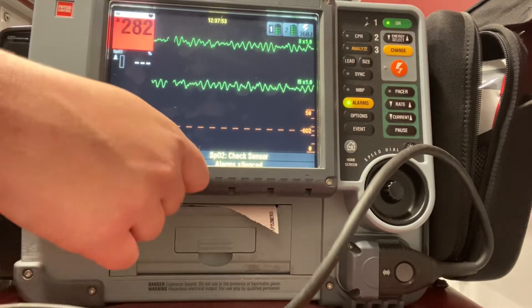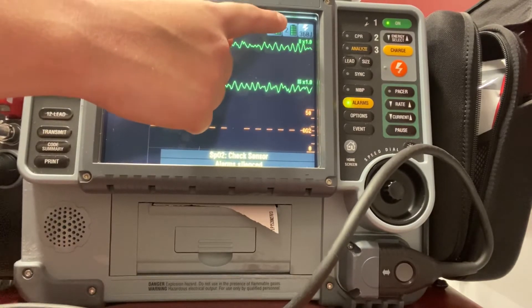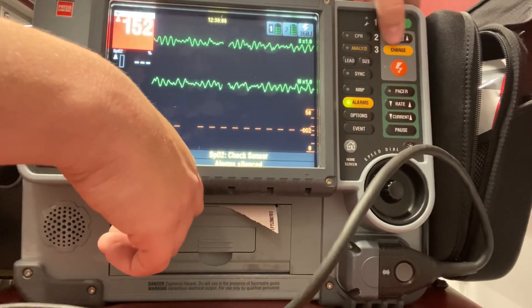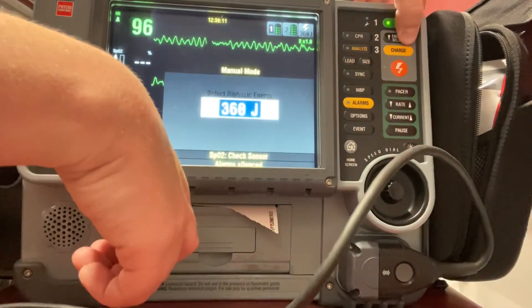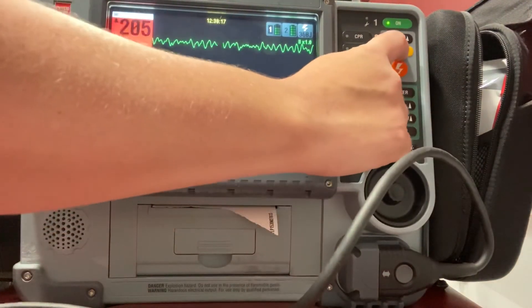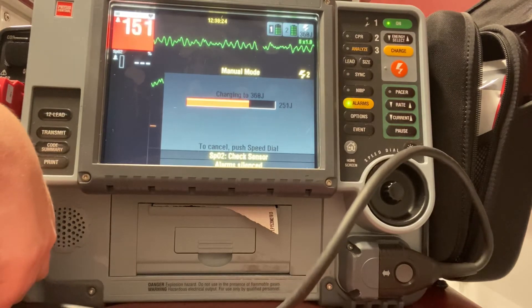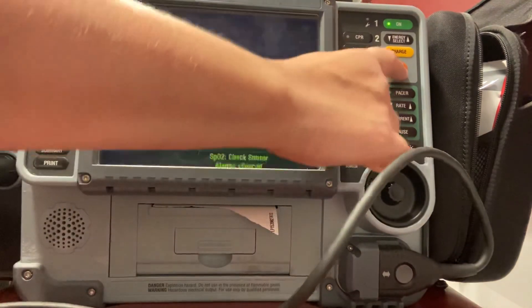I still have V-fib on my monitor, so I want to shock this patient. As you can see, my LifePak has automatically upped my joules to 360, and it'll stay at 360 for the rest of the time. So again, I can skip the energy select. Now, if your monitor doesn't automatically stack your shocks and up that joule setting, you can hit energy select and then just select your energy. But since this is already stacking it for me, I can just go ahead and hit charge. I'm clear, you're clear, we're all clear of the patient. Go ahead and shock.